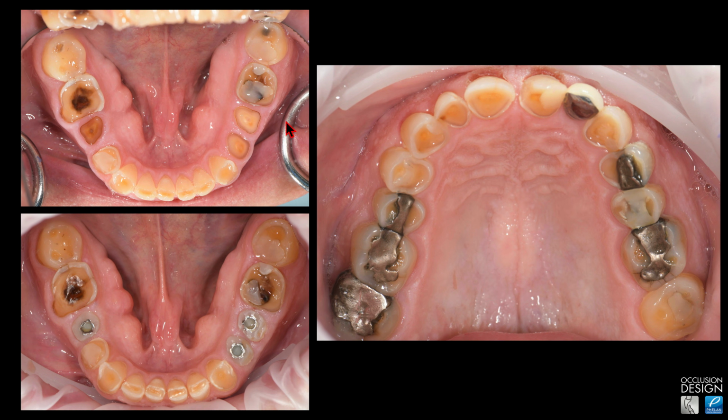This is the before lower. This is the before upper. I had a consultation with Dr. Nahid Mohammed and Dr. Yosef Nemias, trying to figure out if we wanted to try and keep these teeth with crown lengthening and endodontics, but neither of them felt it was a good idea, nor did I. I just felt that we need to be thorough and have these consultations. What we decided on was immediate implants for the 3 bicuspids with custom healing abutments. So, immediate implants with custom healing abutments.